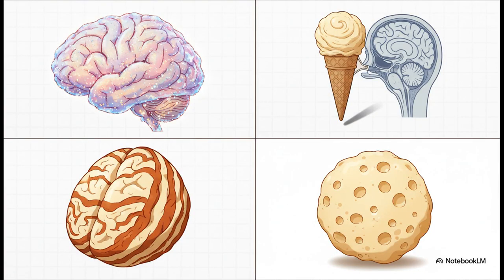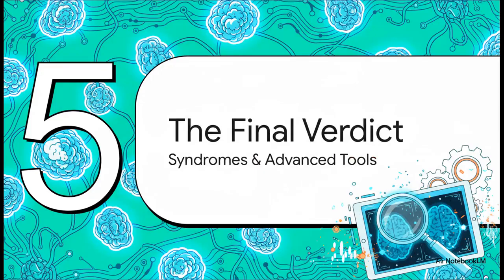All right, you ready for a rapid-fire round of smoking guns? Let's go. Zuckerguss, that's German for sugar icing, describes how medulloblastoma coats the brain surface. We already talked about the plastic or toothpaste tumor for ependymoma. Swiss cheese, central neurocytoma. The ice cream cone sign, that's a vestibular schwannoma peeking out of the auditory canal. These aren't just funny names, they're powerful shortcuts to the right answer. We are so close to closing this case.